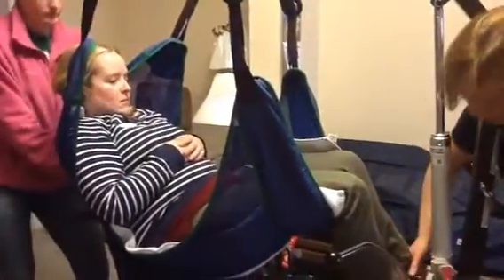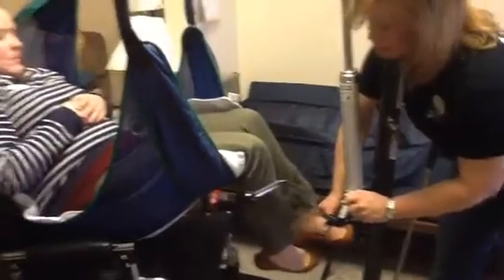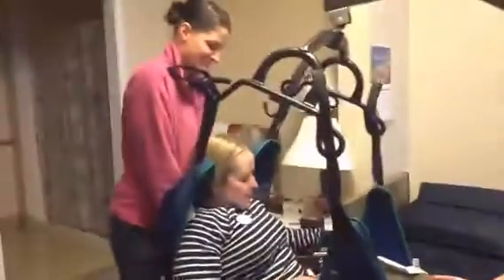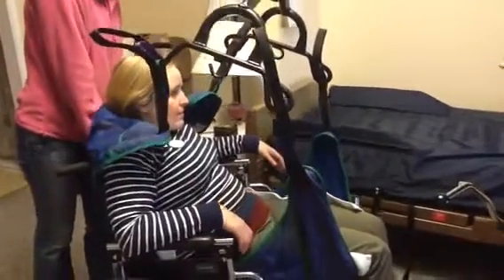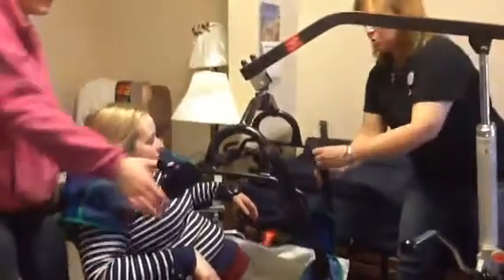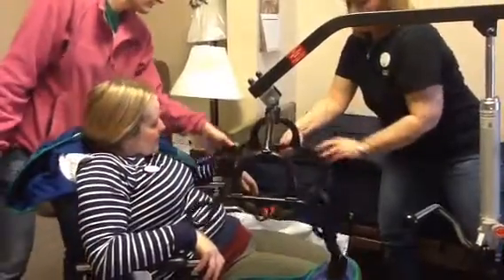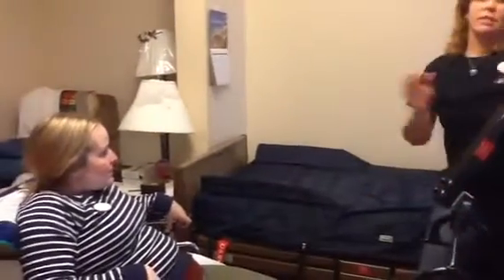Patient's in line, there's a knob, or sometimes it's a button. You release it slowly. Second person guides. You might have to roll the Hoyer back, and you gently lay the person in the chair. Person goes all the way down. They're seated. You remove the sling off the bar, but then you leave the sling under the resident because you're going to have to get them back into bed. The sling's already in place.